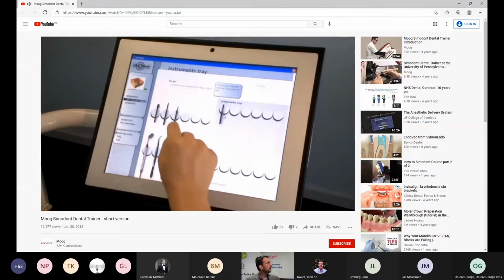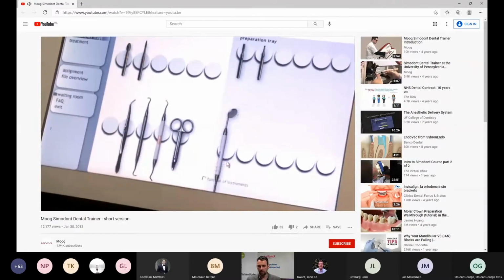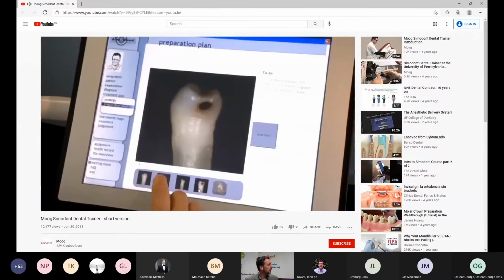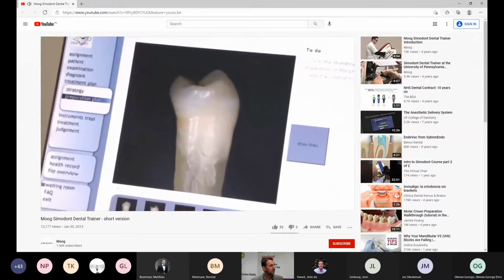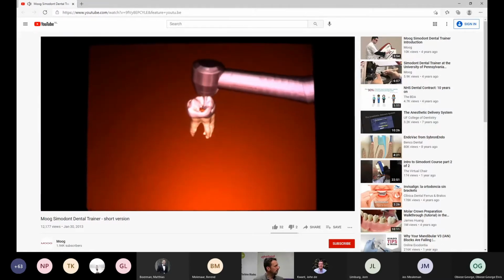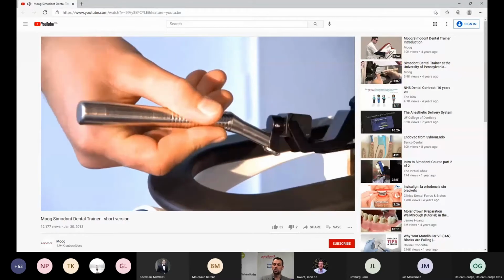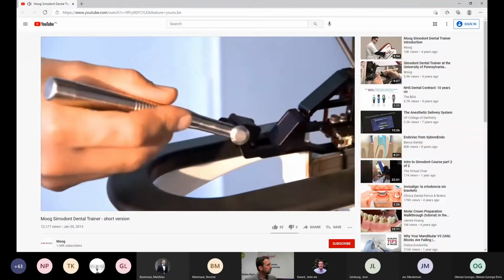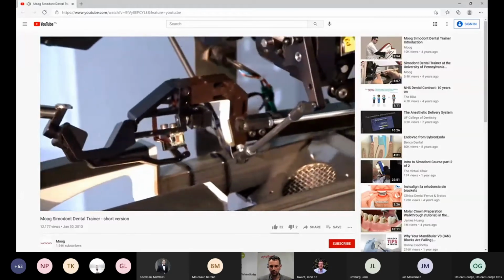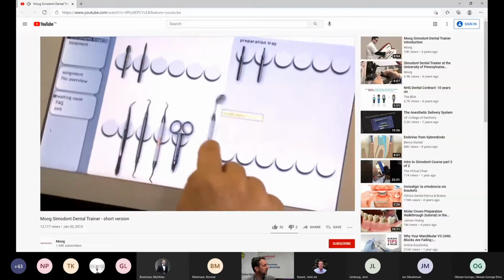You need to be able to select the tools to make a proper training, log in as a student: "Hey, I'm Jos and I want to practice this and this and that." It has to have proper visuals. It had to be integrated in the courseware. That was the development, not of just haptics, but of the whole simulator. So this is what I want to tell you about. How did we get to this simulator? You see motors, force sensors, but there's way more to the development of a simulator.